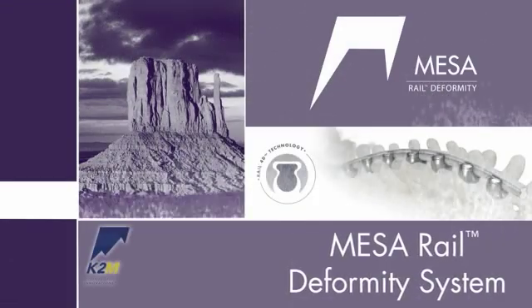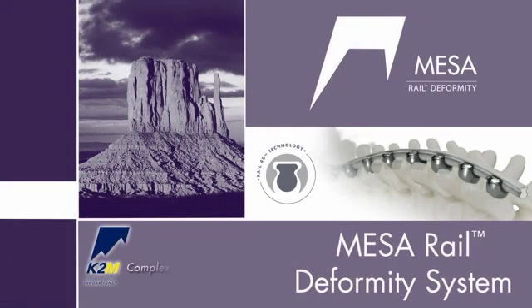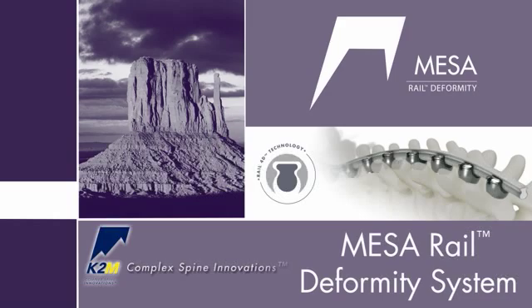Introducing the MESA Rail Deformity System, featuring Rail 4D technology from K2M, Complex Spine Innovations.